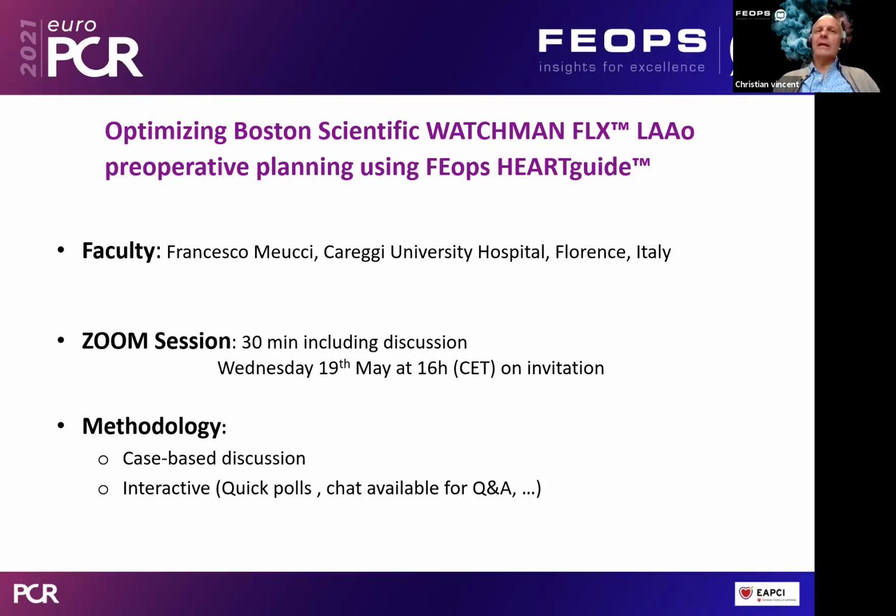The methodology is very clear. It will be a case-based discussion. We would like to be as interactive as possible because it's an education village. So do not hesitate to ask all the questions that you may have. For that, we have a chat line that you can see on your Zoom screen below. Please just put your question there. I will summarize those questions and ask them to Dr. Meucci at regular timing. The other way for having interaction together, we will also have some quick polls or questions. So please, if you can, just answer those questions.